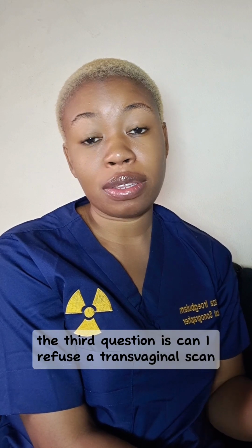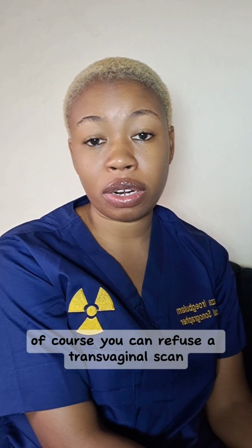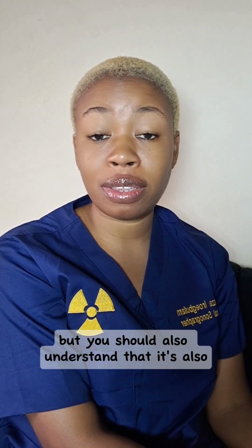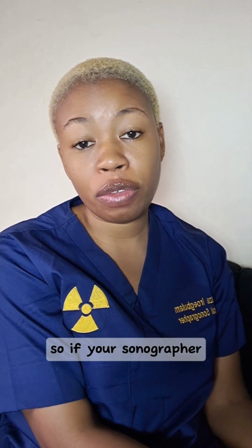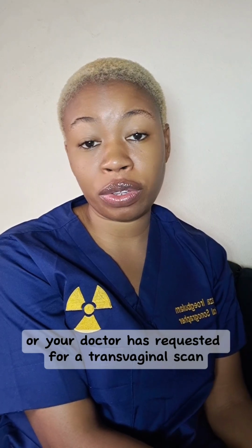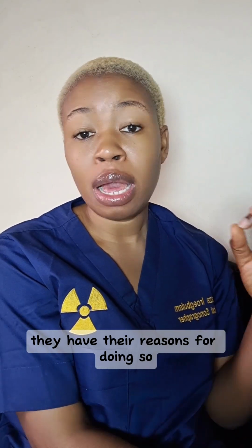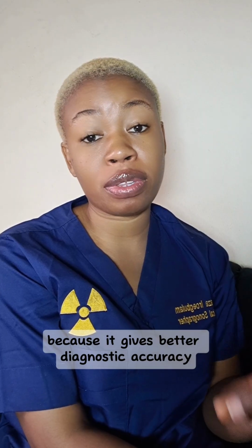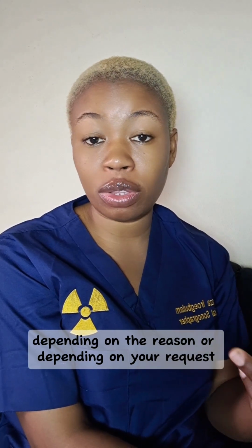The third question is, can I refuse a transvaginal scan? Of course, you can refuse a transvaginal scan, but you should also understand that it limits your diagnostic accuracy. So if your sonographer or your doctor has requested a transvaginal scan, they have their reasons for doing so. Please make sure you adhere to them because it gives better diagnostic accuracy, depending on the reason for your request.